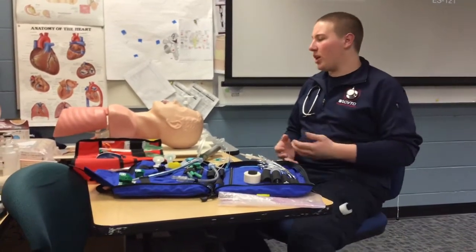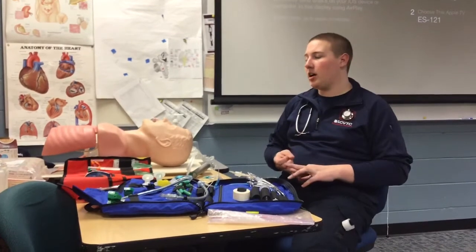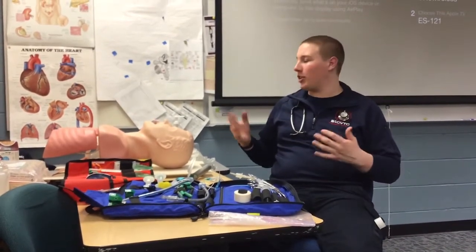Some complications you could run into would be if the tube goes into the esophagus instead of the trachea. In that case, you'll have to pull it back and then try to get it back into the trachea. Or if you go main stem, which is going into one bronchi versus the other, you'll have to pull back a little bit so that you're getting air into both lungs. And then if there's any aspiration or blood or any mucus, saliva or anything like that in the tube, you'll want to have suction ready to suction the airway so that it's a good airway.